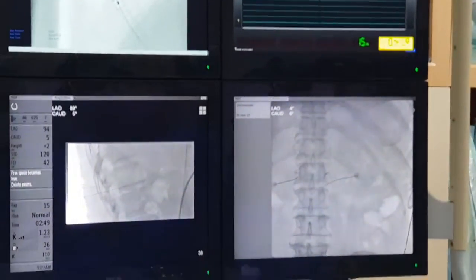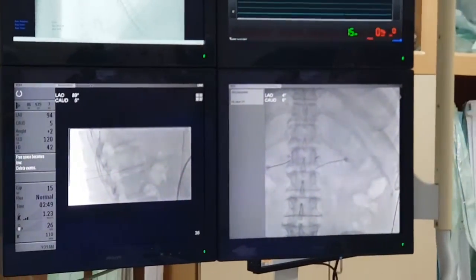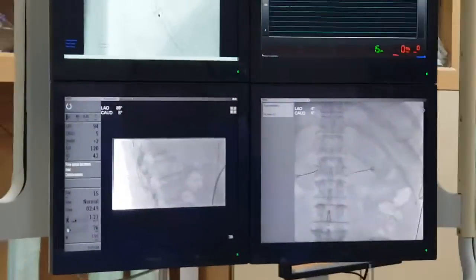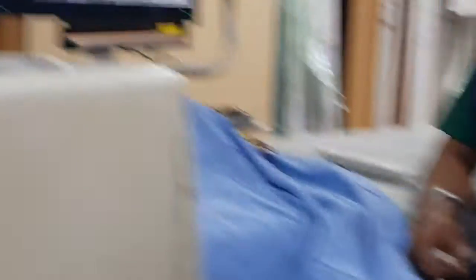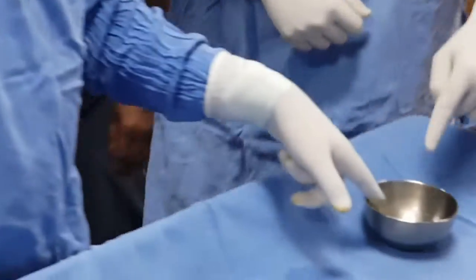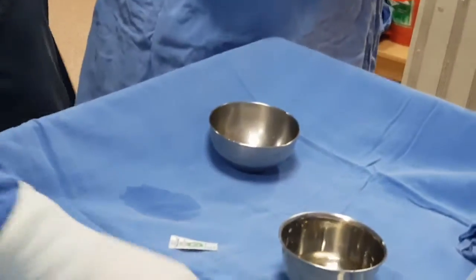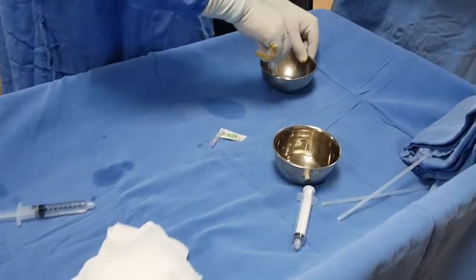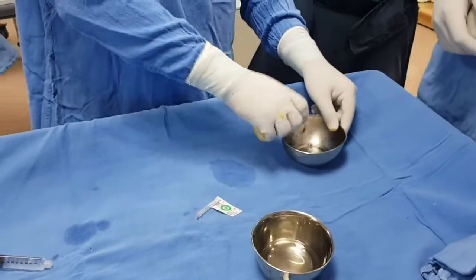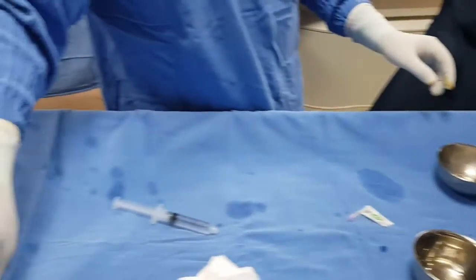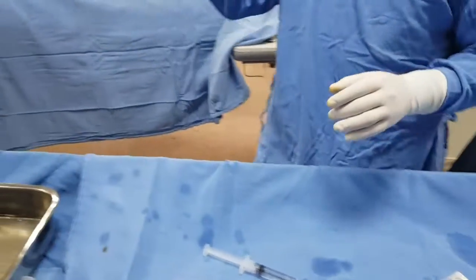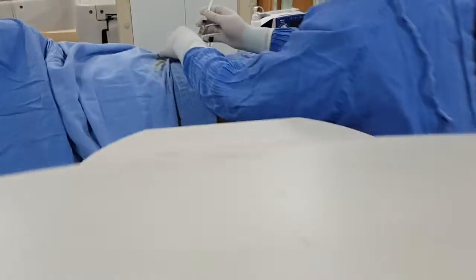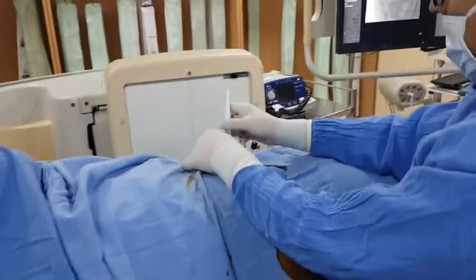That is not the actual AP view — we will show you the AP. We will instill some absolute alcohol. We will begin with some contrast, make it 50%, and instill some contrast to see where it is going.